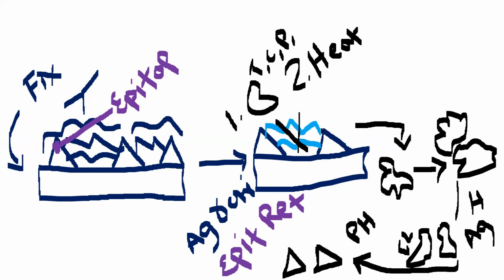By heating, obviously we are denaturing the proteins. Then we have two types of proteins. We need not worry about the crosslinks, but the antigen needs to be returned to its original shape. That original shape can be achieved by adjusting the pH, depending upon the type of antigen that we need to retrieve. According to that antigen, we adjust the pH, and we can get the original shape of the antigen that we want.